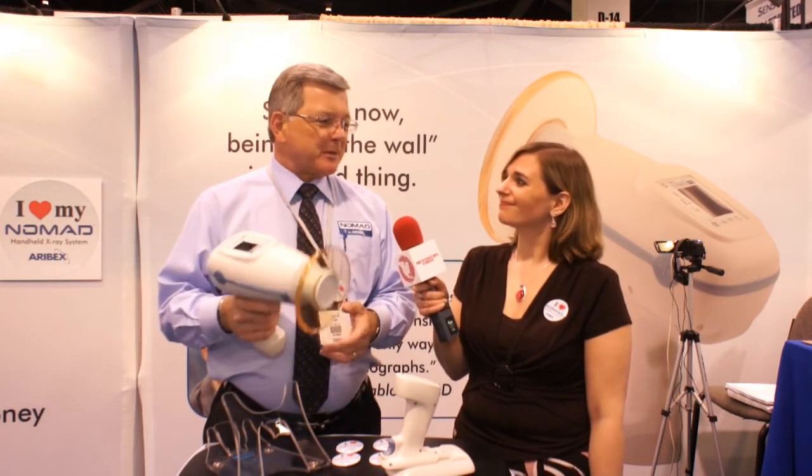People ask me who buys this thing. Well, it works in general practitioner offices, whether you're building a new office or refurbishing one. One of these takes the place of three to four wall mounts, which saves you money and space. As I like to say, hang a picture — don't hang a wall mount. Make the office look nice.